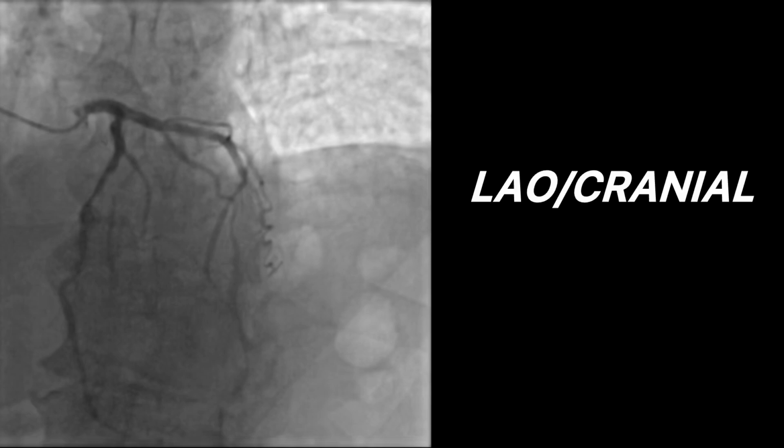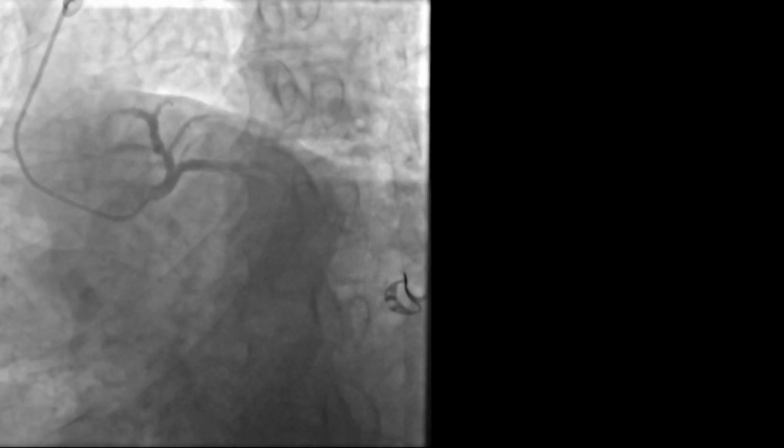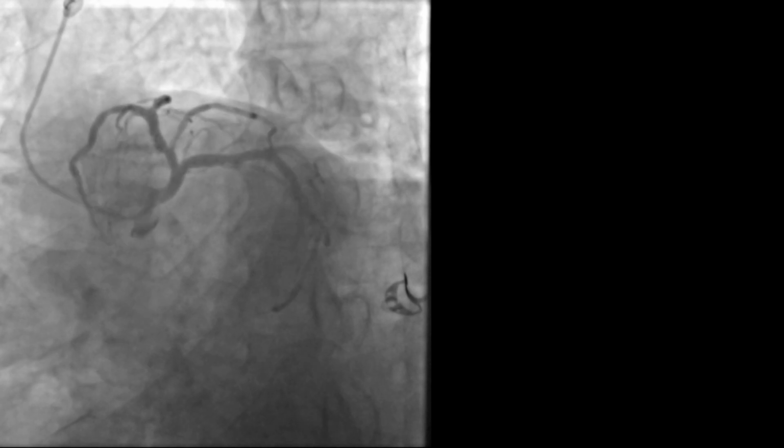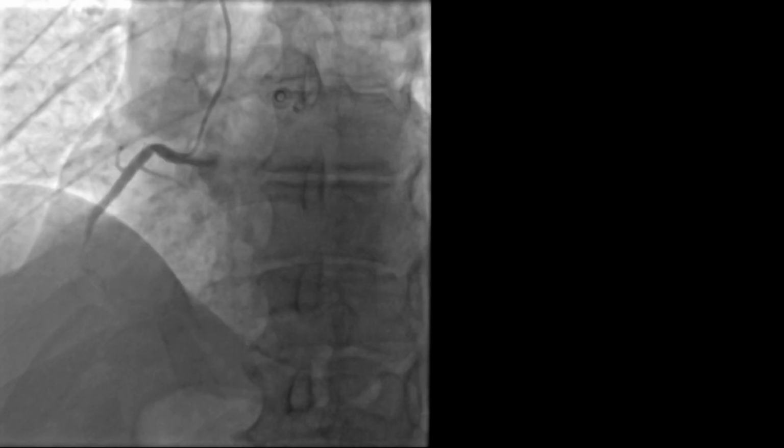To get a better look, we switch to the cranial view, where the severity of the LAD stenosis becomes much more apparent. Finally, in the spider view, we notice that the proximal LAD is slightly ectatic. For this specific segment, we've decided on medical management for now.